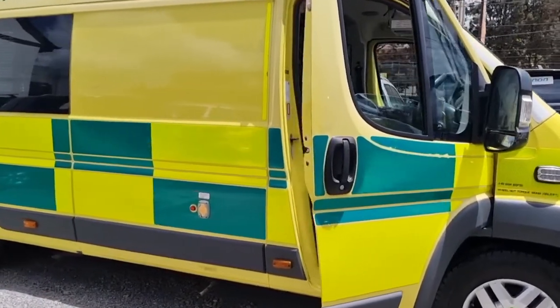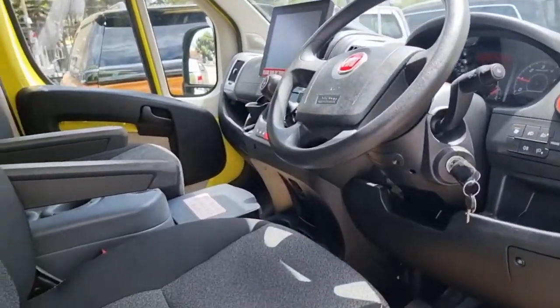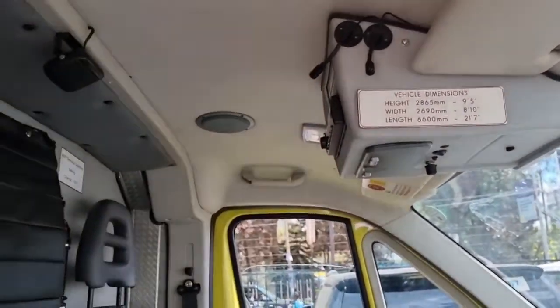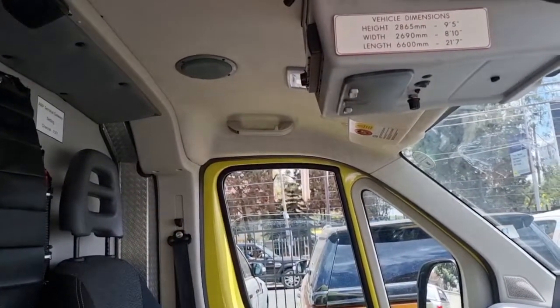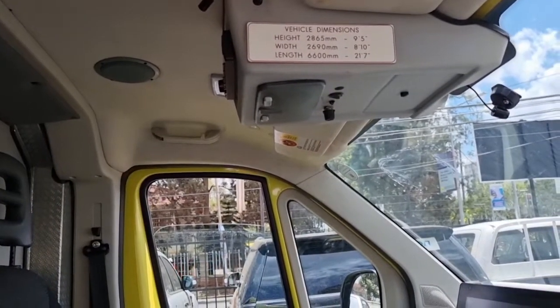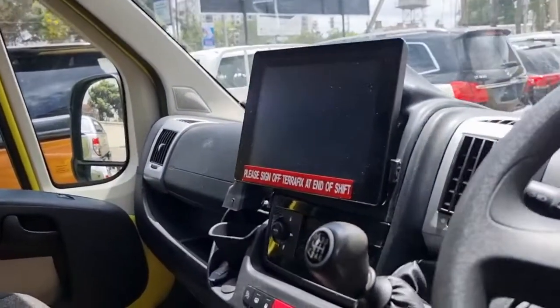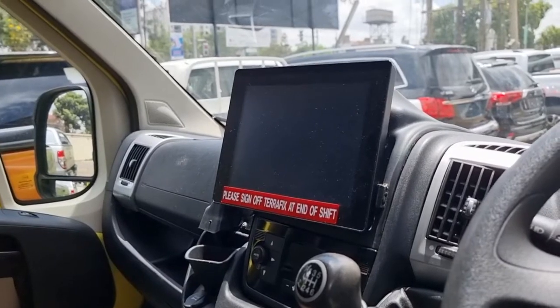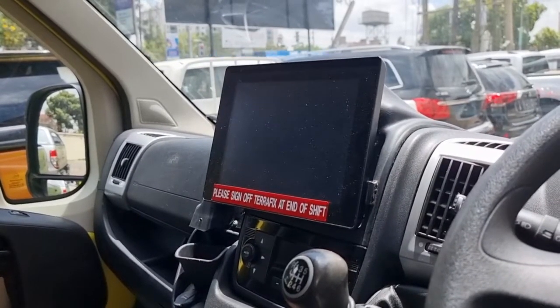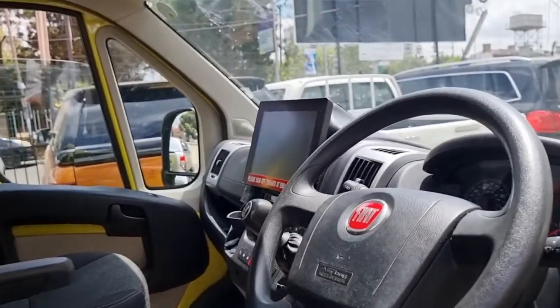So let's take a view inside how the driver is going to feel and what's inside the driver's compartment as well. So as you can see, there is a fire extinguisher. Then those mics there are actually to enable the driver to speak to the nurse or the doctor who's inside the ambulance, so that they can speak without any hindrance. So that's available as well. And then you've got this system which enables you to talk to the hospital and give them information about how far you are and how critical the patient is and all the other details as well. So let me just jump in.